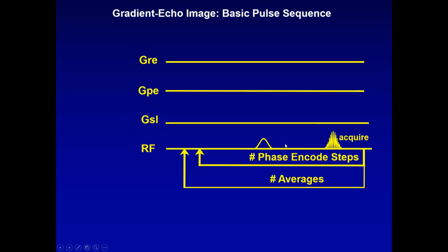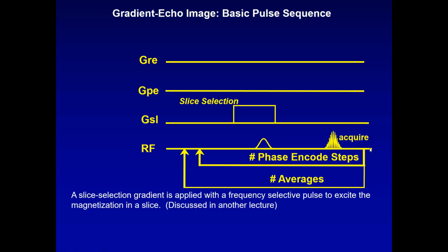So a pulse acquire experiment is there's a radio frequency pulse, and then we open the receiver. That's a pulse acquire experiment. And note that it's subject to T2 star effects. We don't recover these inhomogeneity components like a spin echo would give you. But we usually want to see what's happening in one slice at a time. So we put on a slice selection gradient.